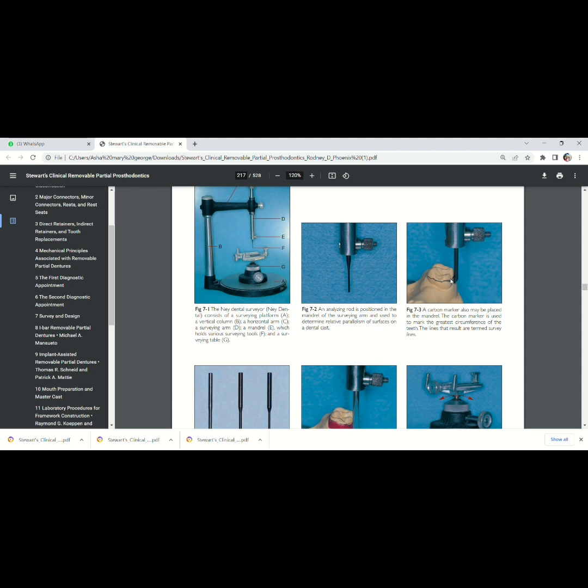First, analyzing rod. Second, carbon marker. The analyzing rod is used for locating the height of contour. If the analyzing rod is in contact with the tooth surface, you can make out where is the height of contour and the area below the height of contour.